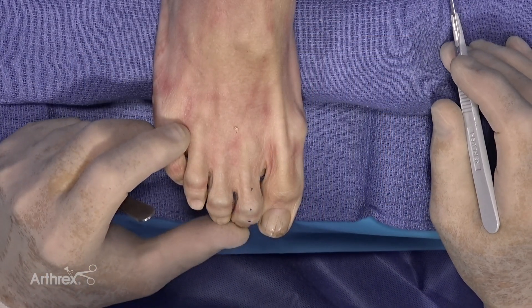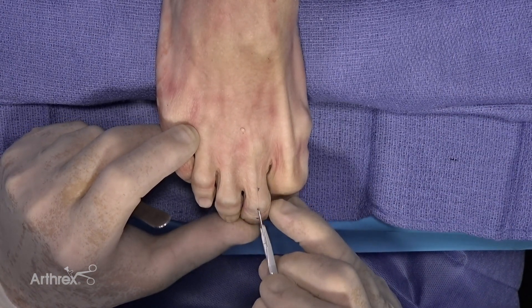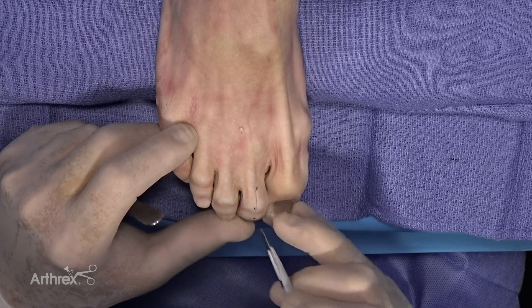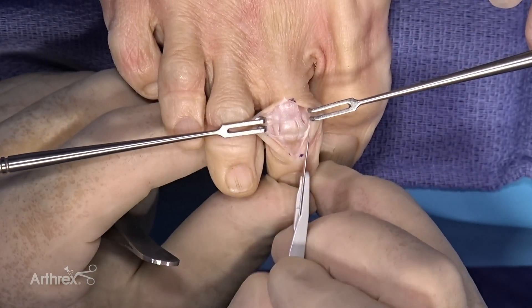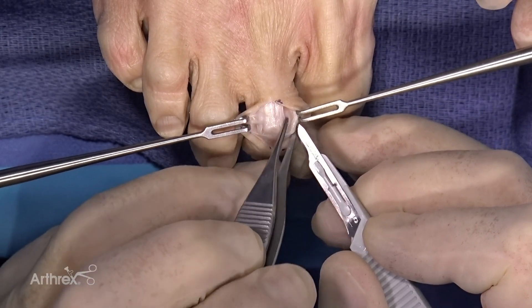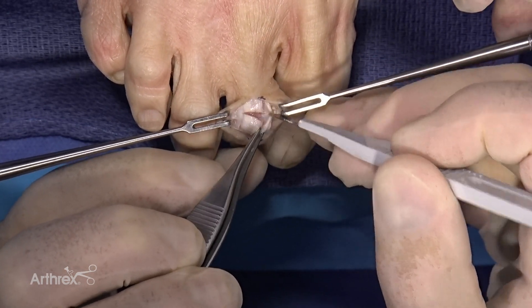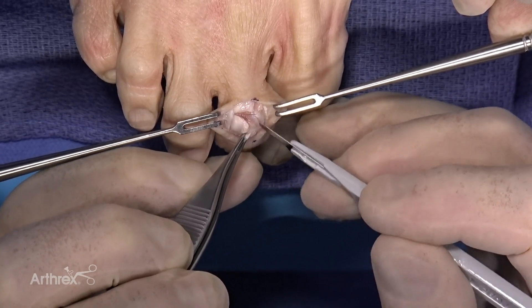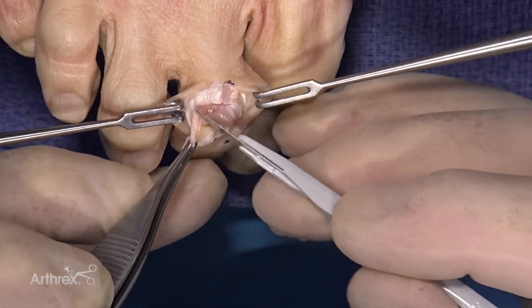In this demonstration we're going to do a Dynanite hammer toe implant. We've marked a dorsal longitudinal incision and I'll go ahead and do our vertical cut, deepening through the soft tissue right down to the capsule. I'll usually flex the tip of the toe to help expose it. Now we can see the capsule and the extensor tendon, which is part of the area we will excise. Once the longitudinal incision is made, we go horizontally and do an elliptical incision.